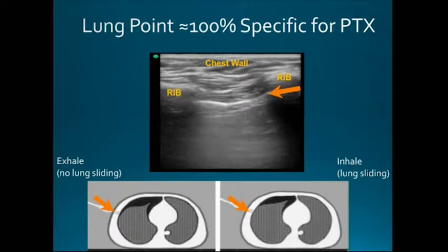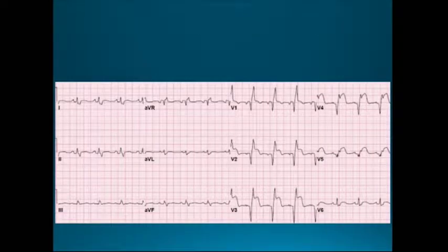And so lung ultrasound is kind of like this, right? This does not look like the heart. But does anybody look at this EKG and recognize this person has a heart problem? So you might look over here to see the ST elevations here in the anterior leads. This person, we are not the droids this person is looking for, right? They need another doctor. So it's just like that. The EKG doesn't look like the heart. EEGs don't look like the brain, but the artifacts they create or use give us lots of useful information. Lung ultrasound is just like that.